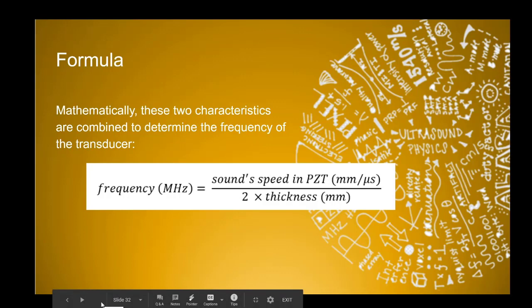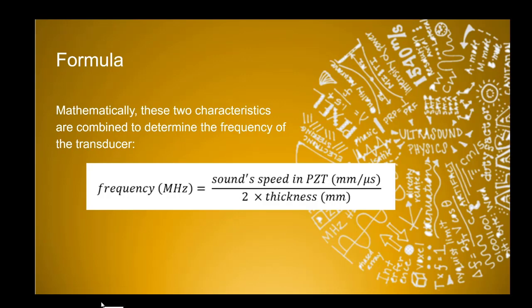And that is the end of transducers. So the biggest part with transducers is going to be remembering all the components of the transducers, remembering what they do, and then out of this chapter, make sure that you really understand how the backing material affects the transducer, how bandwidth works, why Q factor is what it is and what it does, and then understand the concept that when the PZT crystal has certain speeds versus thicknesses, what that does to the frequency.